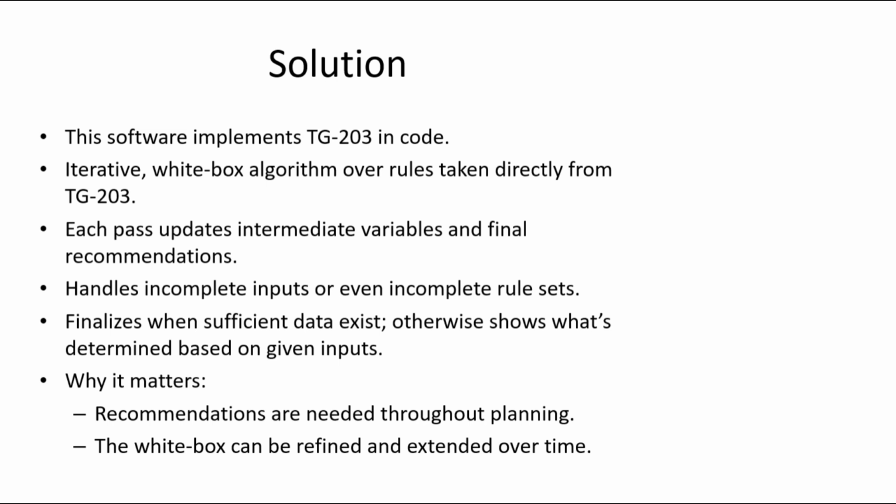Each pass updates intermediate variables and final recommendations. It handles incomplete inputs or even incomplete rule sets. Finalizes when sufficient data exists, otherwise shows what's determined based on given inputs.